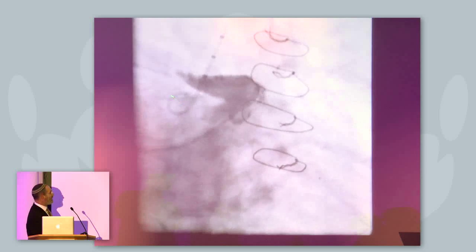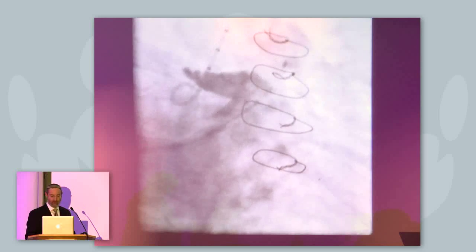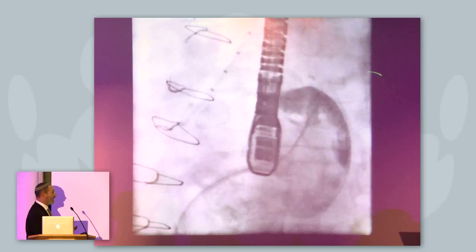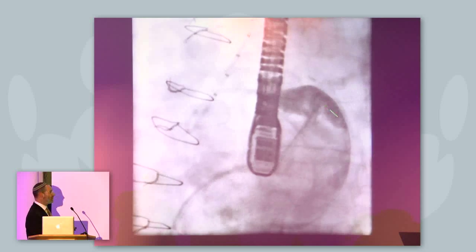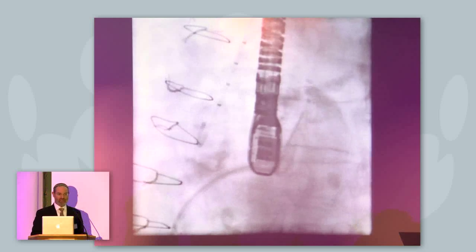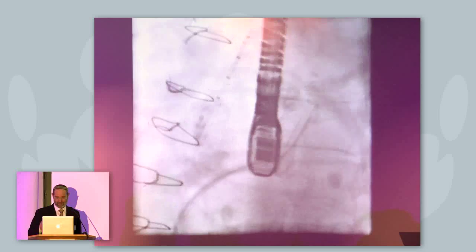So this appears to be quite a distance and not what we would normally call a pulmonary vein ridge. The second thing is I have no clue in a lateral view where the ostium is. There is no ostium. There's no osteal definition. So I've got something that's going in the wrong direction, and it's not giving me any of the signs that I would normally like to see.